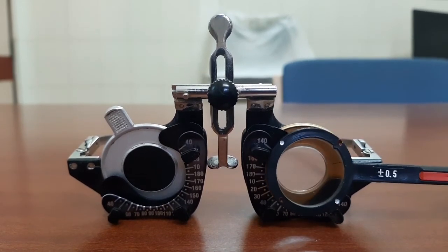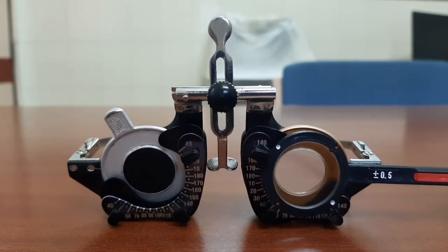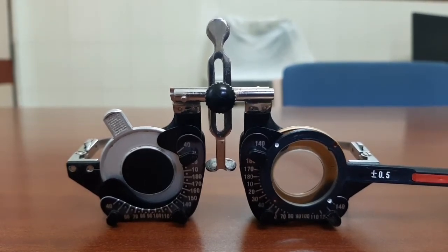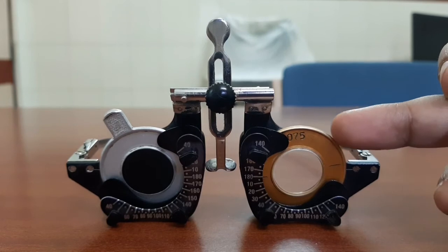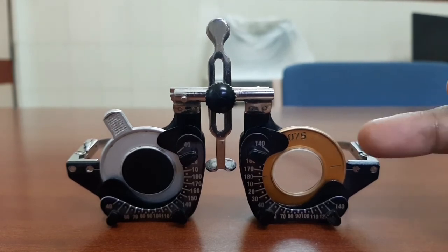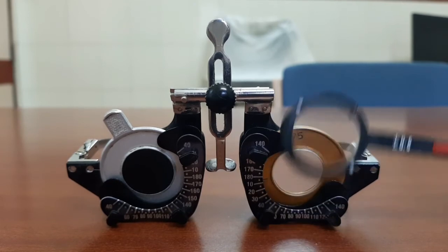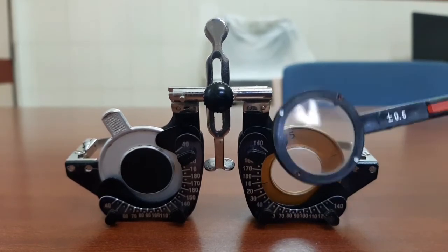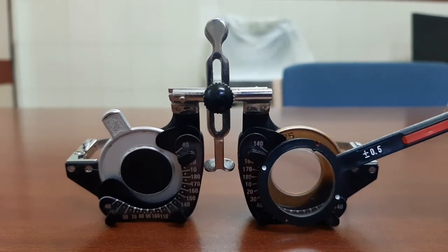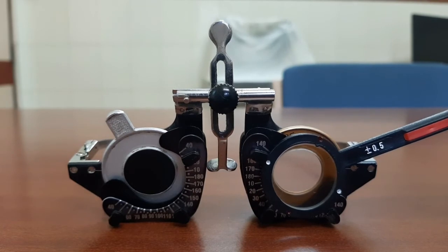Flip the lens and ask the patient which side they prefer. Note the sign of the cylinder being used and move the trial lens accordingly. Since the sign is minus 0.75, move the cylinder towards the red dot — move it 5 degrees towards the red dot. Then repeat the procedure: the axis of the cylinder in the trial frame will again coincide with the JCC axis. Flip again and ask which side the patient prefers.